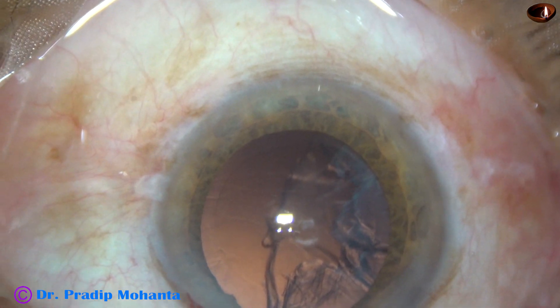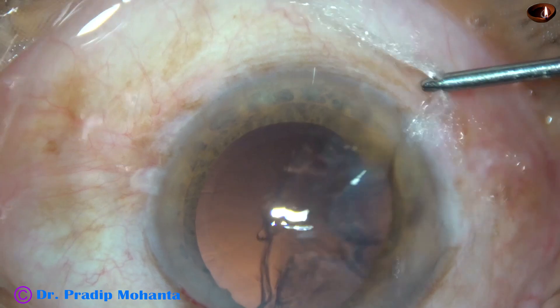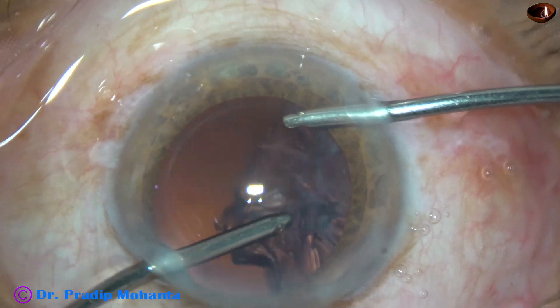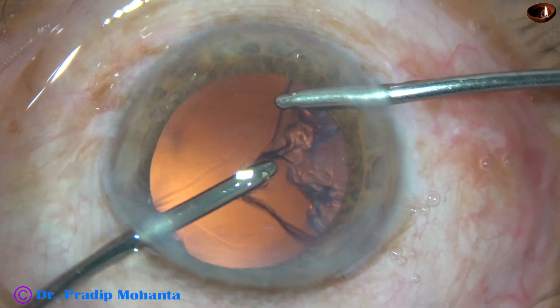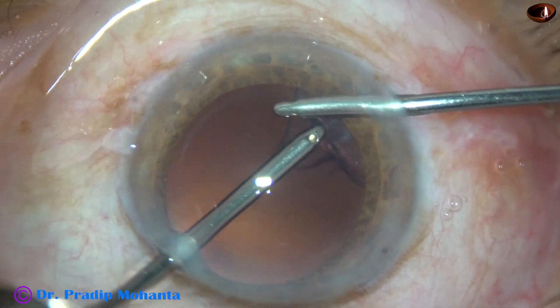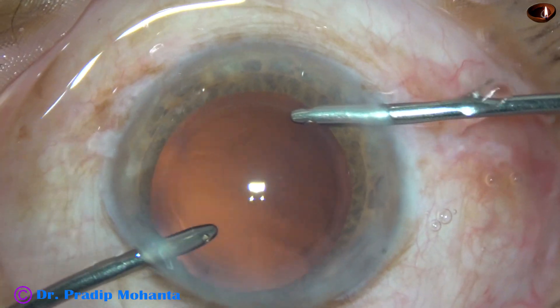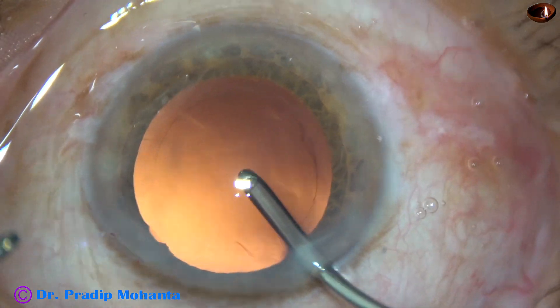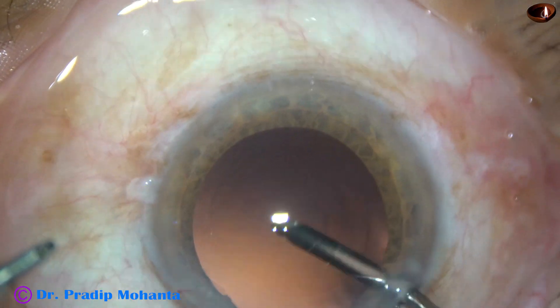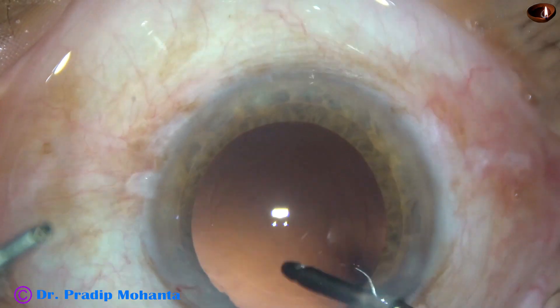And now the irrigation cannula goes to the right side port, aspiration through the left. This half of the cortex is removed by bimanual irrigation aspiration. And it is done. Watch hydropolish — this is how we can polish the posterior capsule just by the irrigating cannula. It is done.